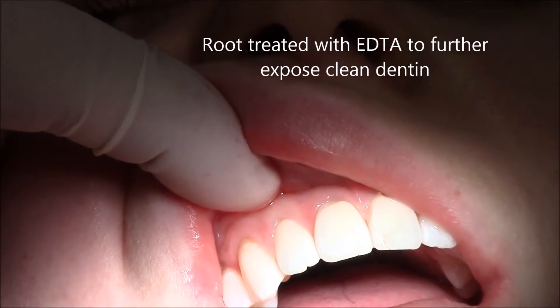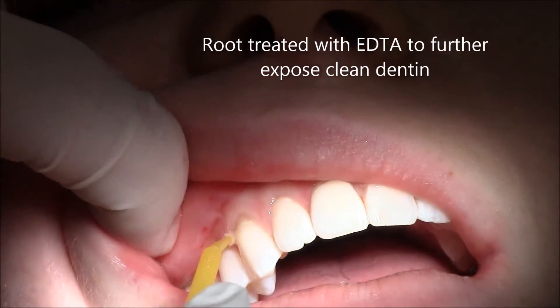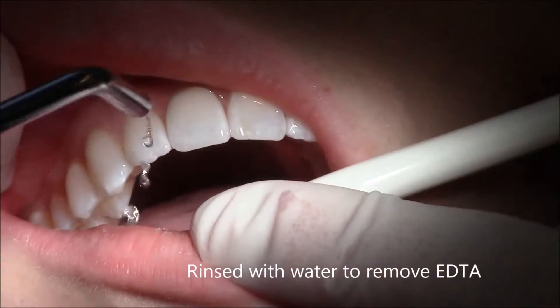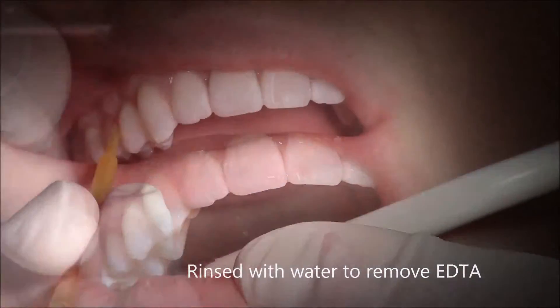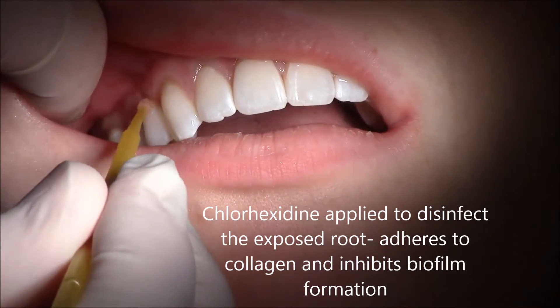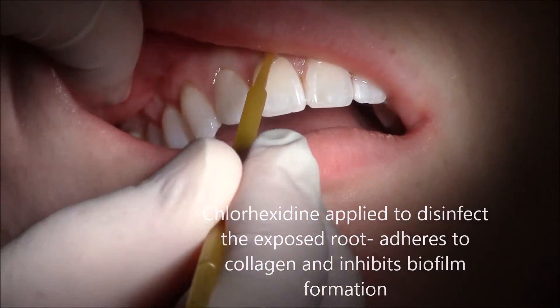First thing after anesthesia is we use a sterile burr to clean the root structure, then we use EDTA which is a cleanser to decalcify and remove any debris from the exposed root structure, allowing a surface we can reattach gum tissue to.